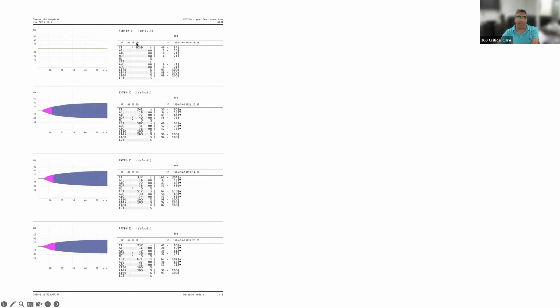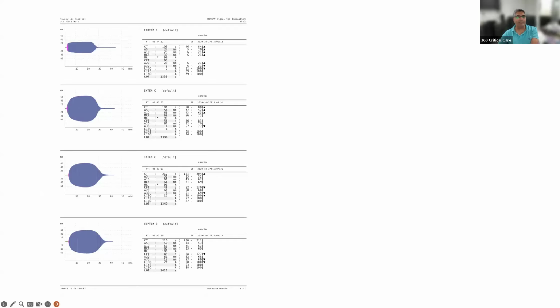The other one will be a high clotting time, and this can also be present if there is hyperfibrinolysis. So there is no fibrinogen and the clotting time is very deranged, and you will get a maximal clot lysis of more than 5% here. But this one doesn't have an ML of 5% or more. So this is probably only fibrinogen deficiency. Early fibrinolysis, you can see that. So you again supplement fibrinogen in this case.